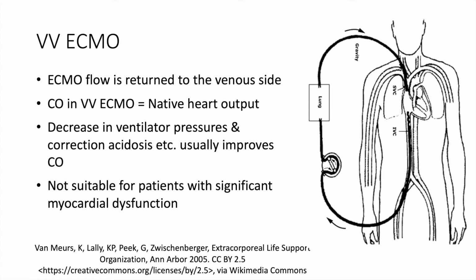However, as there is no direct contribution of the ECMO pump to cardiac output, this configuration of ECMO is not suitable for patients with significant myocardial dysfunction.